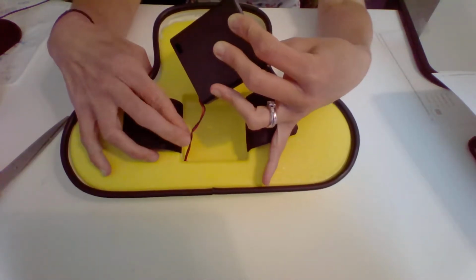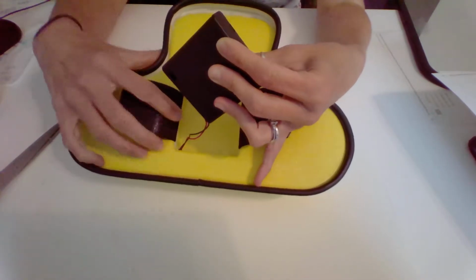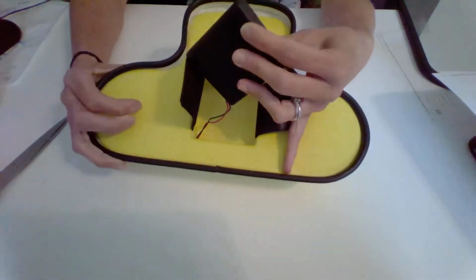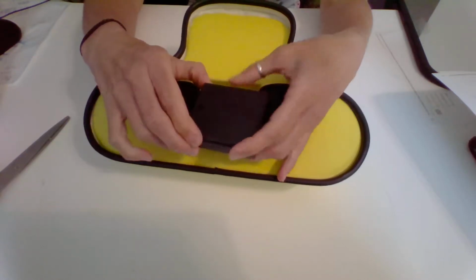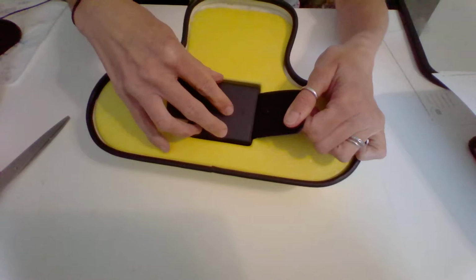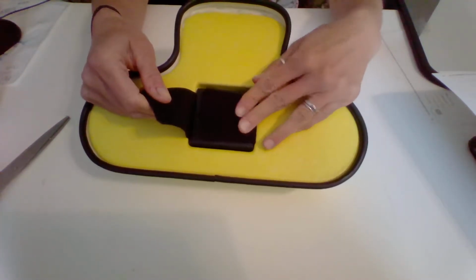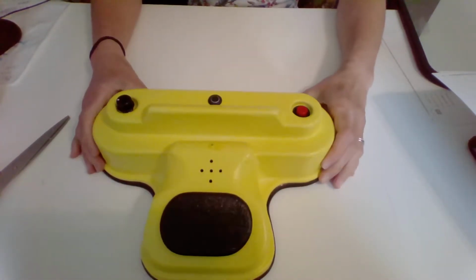It has a little red and black cord that is just attaching the battery power into the device. There's a little hole down there. Again, it's kind of tricky to get in there if you need to, like say your wires become severed somehow. That would be kind of tough to do without destroying it. But you could probably take off this base and then re-glue it back on if you needed to. All right, so you just shut that Velcro again. There it is. It's not going anywhere. Like, we'll shake it. Nothing is wiggling and nothing is moving. Like I said, kid tough.